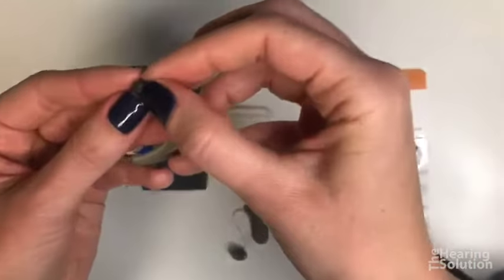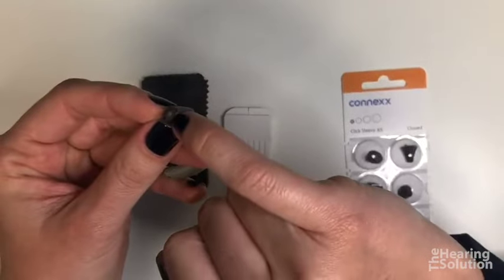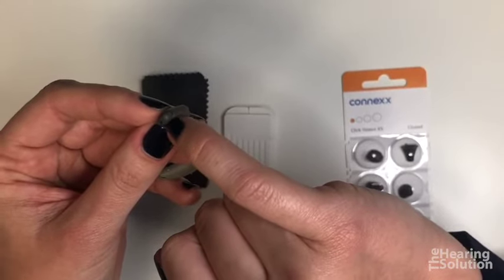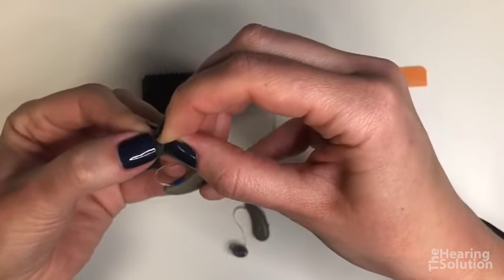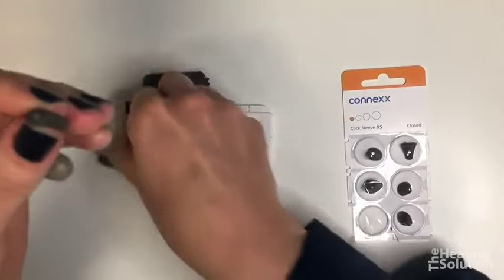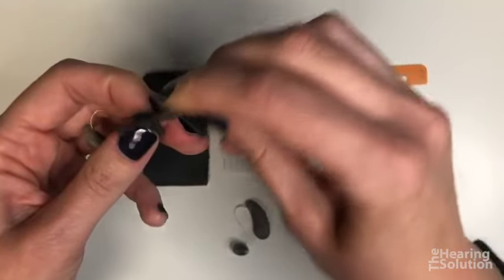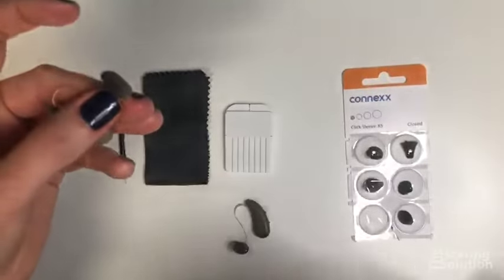Next, what you'll want to do daily or weekly is, if you look really close at the part that goes in your ear, you'll see a little mesh screen. And so you can take your fingernails and almost pinch any wax that's gotten into that mesh screen out. You can also take your brush and brush that mesh screen to make sure there's no wax on the tip going into your ear.